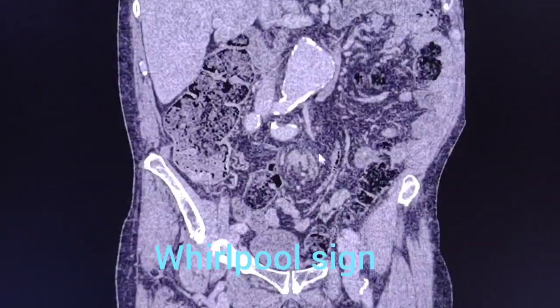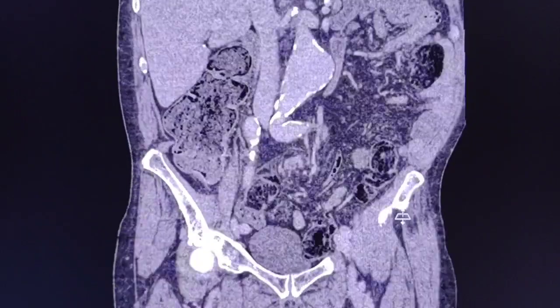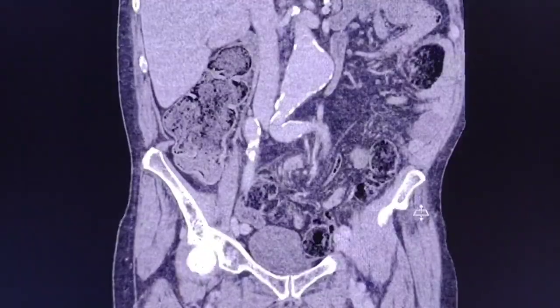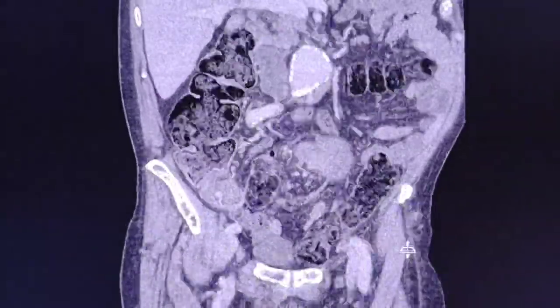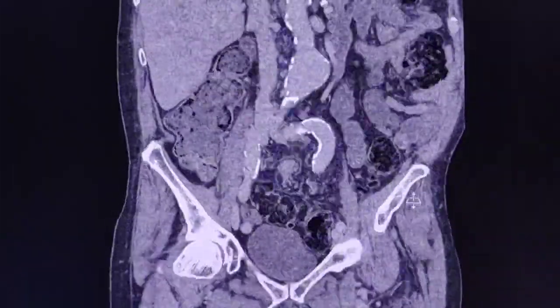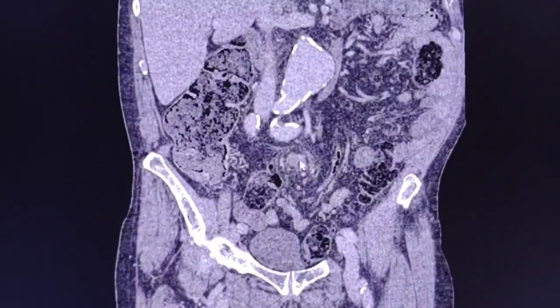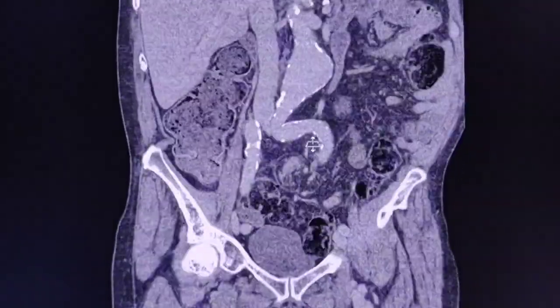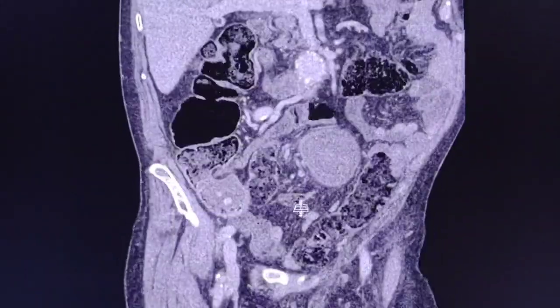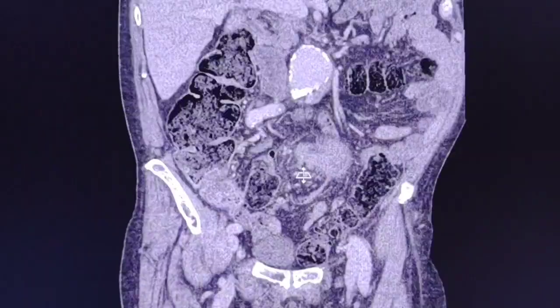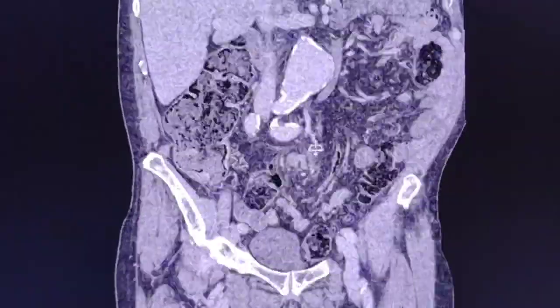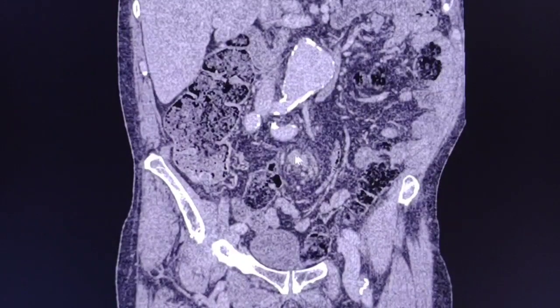Just look at this region. Once again, the whirlpool sign — the twisting point causing the obstruction.